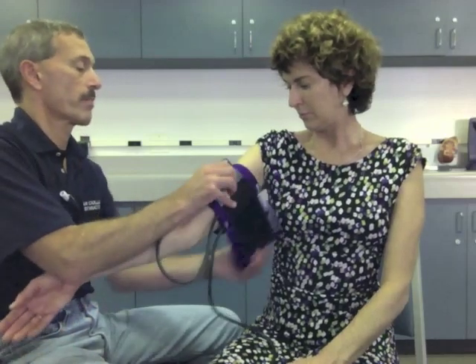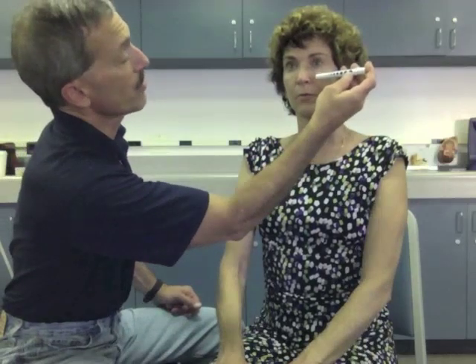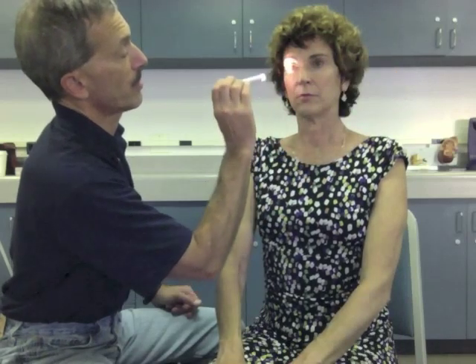Next I'm going to check her eyes. Could you stare at a fixed point on the wall? I'm going to get the size of her pupils first — they appear to be about four millimeters. I'm going to shine the light in both eyes looking for reaction and constriction. Eyes appear to be equal and responsive to light at four millimeters — PEARL at four millimeters.